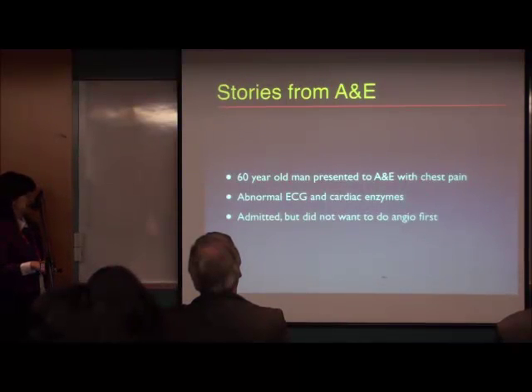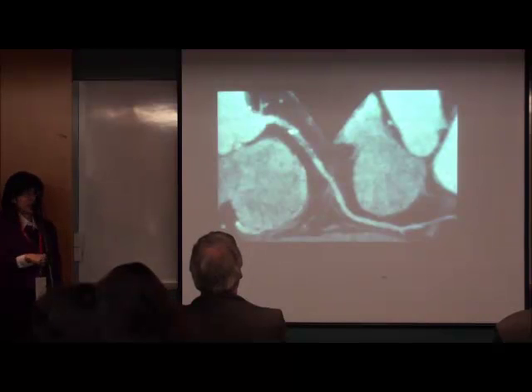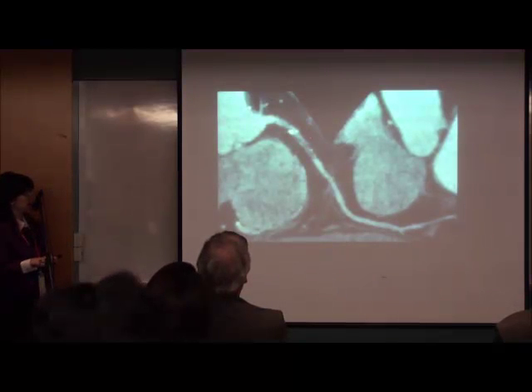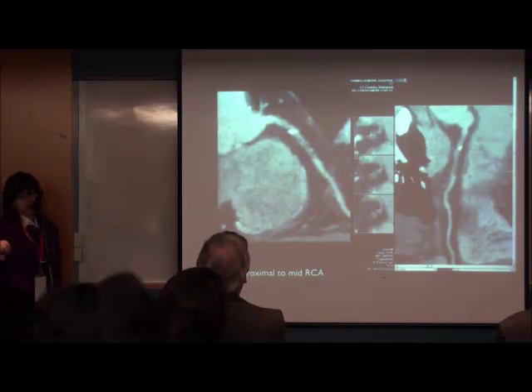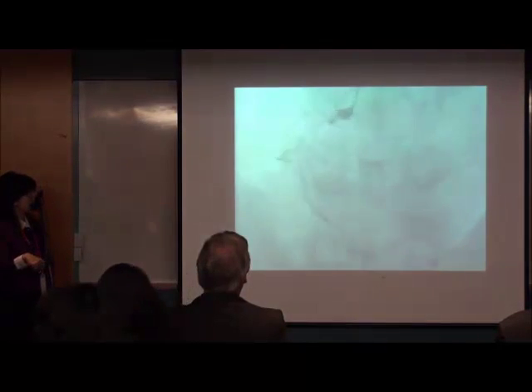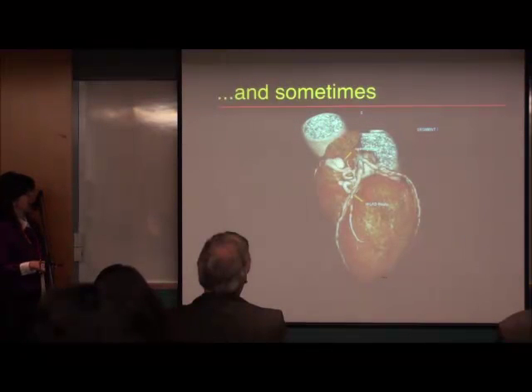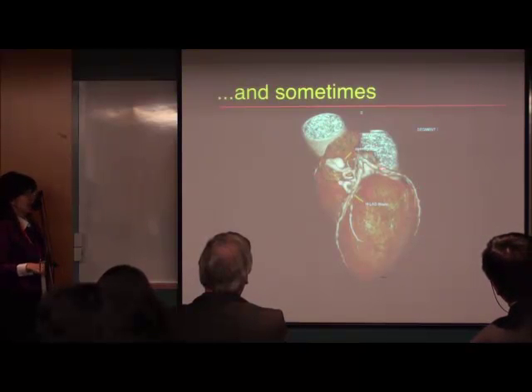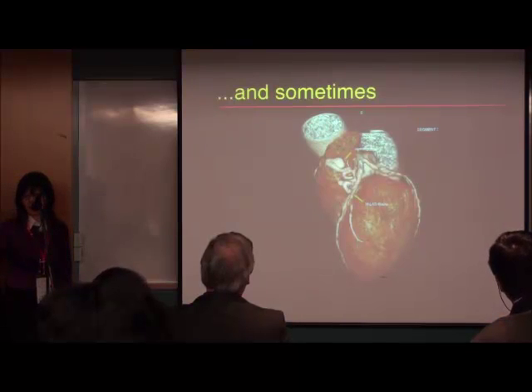A 60-year-old man presented with chest pain and had abnormal ECGs and cardiac enzymes. He was admitted to the cardiac department but was scared to undergo angiography first, so they did a CT scan. CT showed an occlusion of the proximal to mid right coronary artery — a chronic total occlusion — which was subsequently confirmed on conventional cath angiogram. We also occasionally get unusual findings, like this patient who went to A&E with chest pain and was found to have a fistula between the pulmonary artery and the LAD, with a small aneurysmal dilatation, probably causing some degree of steal and causing the symptoms.